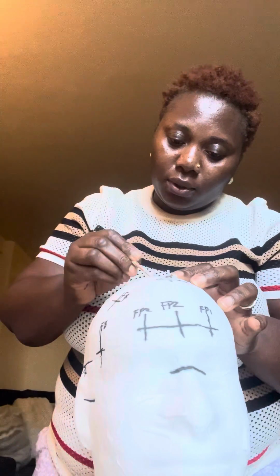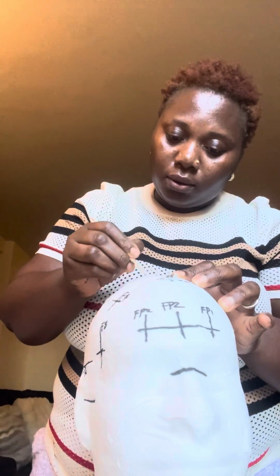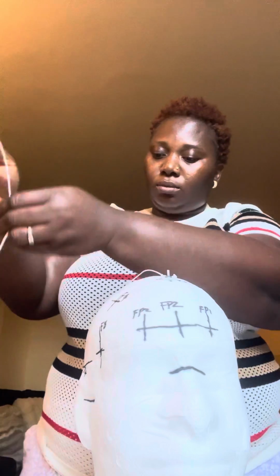I'll prep again, CZ. Place my electrodes.